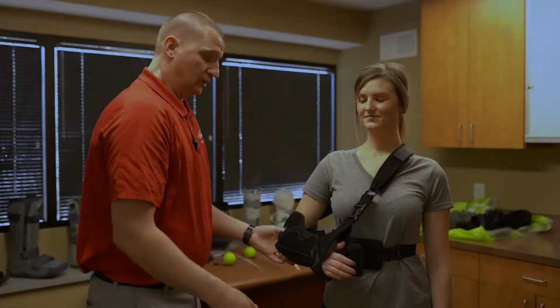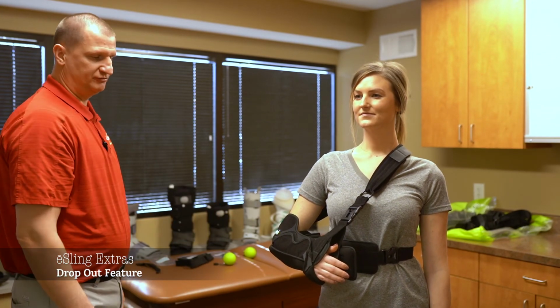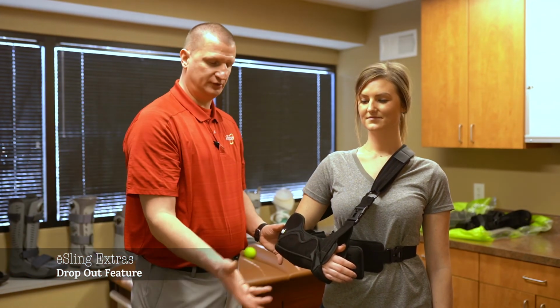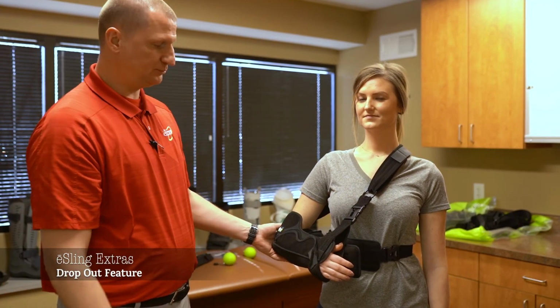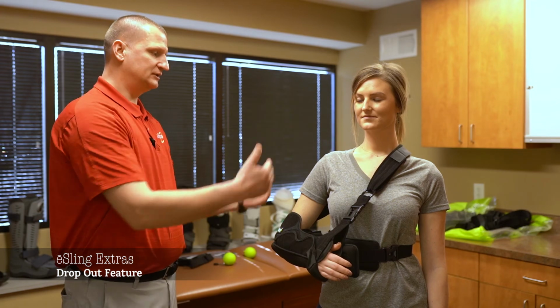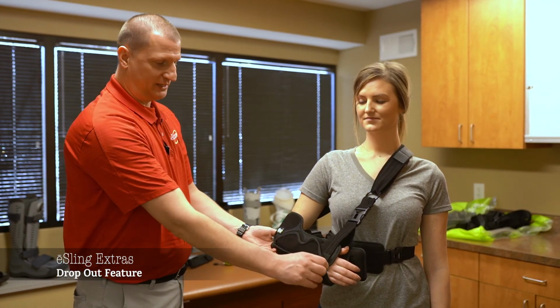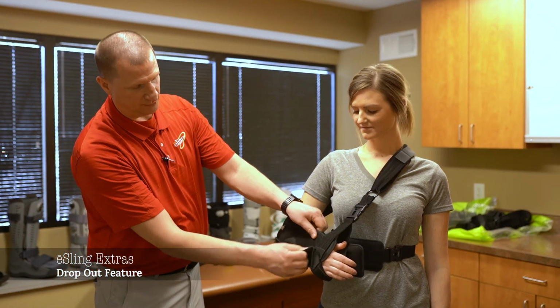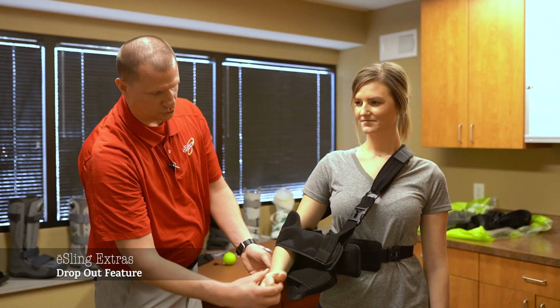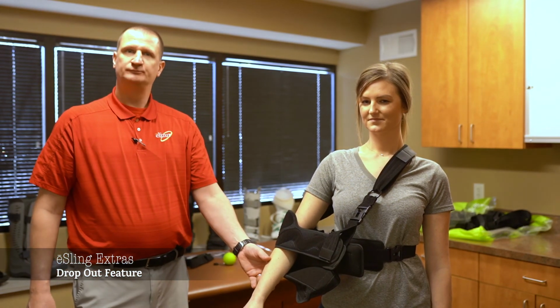Another feature of the eSling Express and the eSling 520 is the dropout feature. This is very useful for patients to do their home exercise program, and they do not have to take the sling completely off. To utilize the dropout feature, the patient will just undo this tab here, and the arm will drop out so he or she can do their home exercise programs.